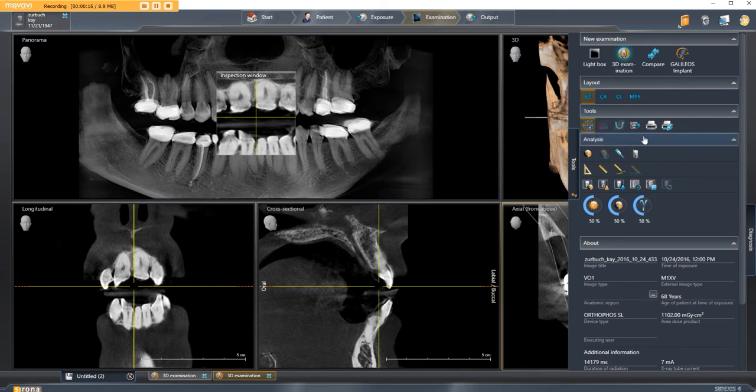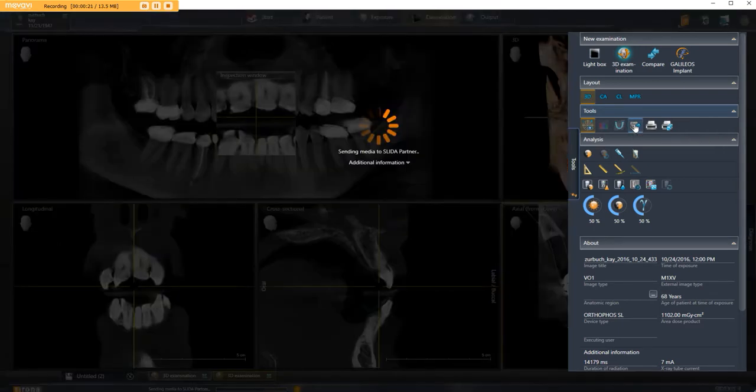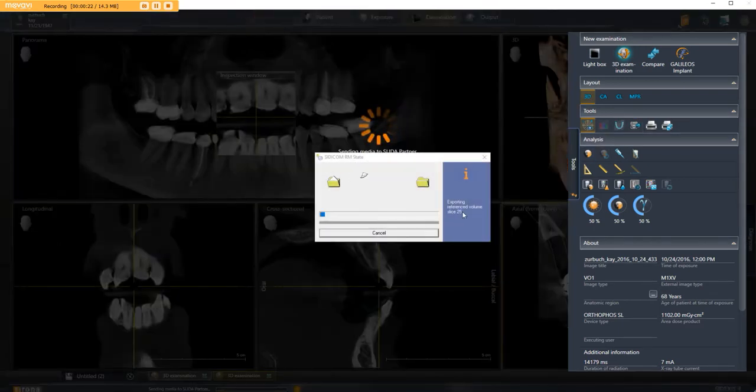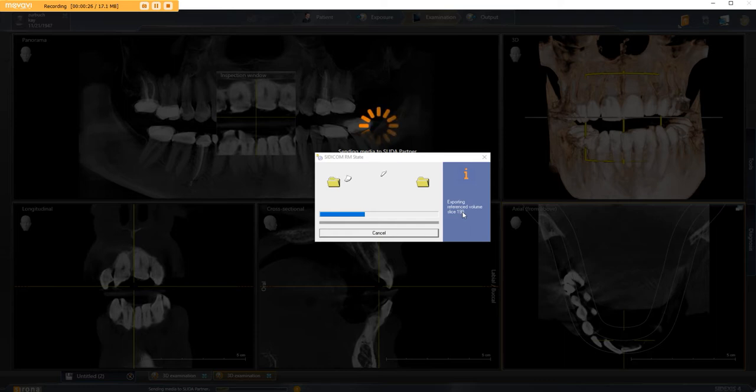Click this little button right here - when you hover over it, it's called Send Image to Communication Partner. It's sending it to my desktop to a folder that I pre-made.